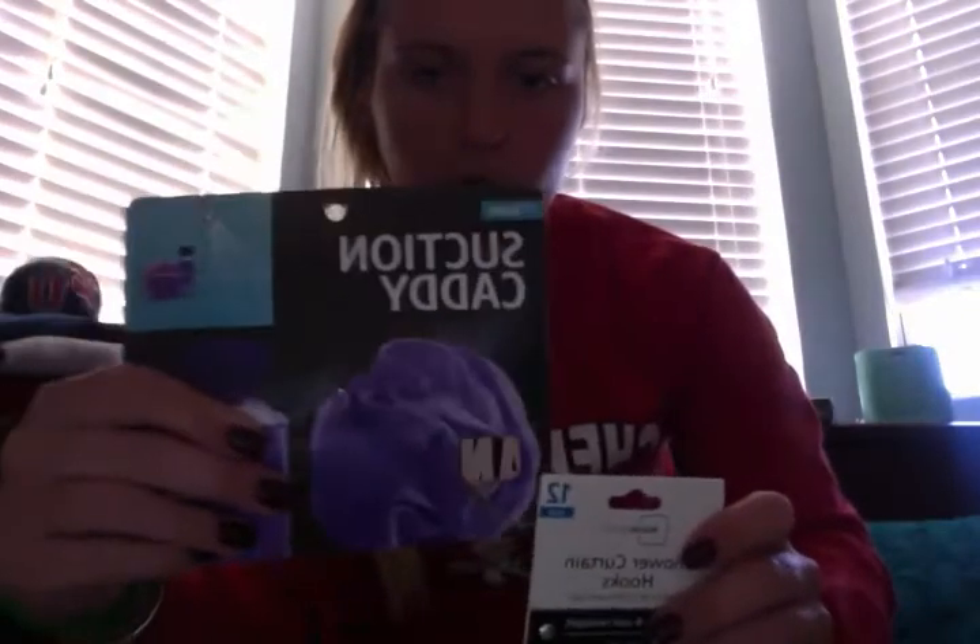Today we're going to make an adaptive basket for a crutch. I went out to Walmart and bought a shower caddy and some shower hooks. Here's my caddy — I already removed the suction cups, they just pull right off.